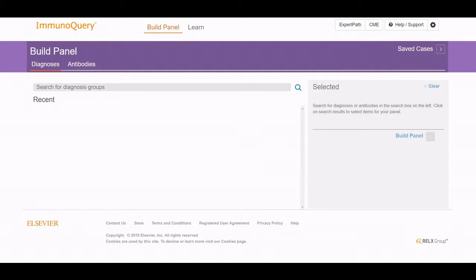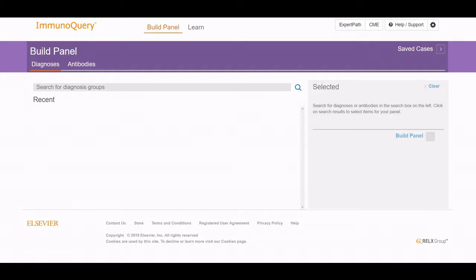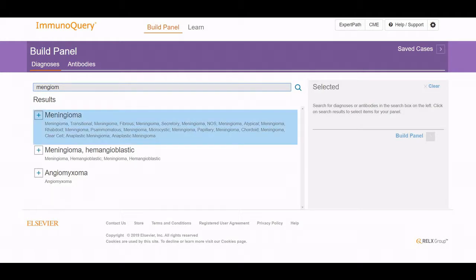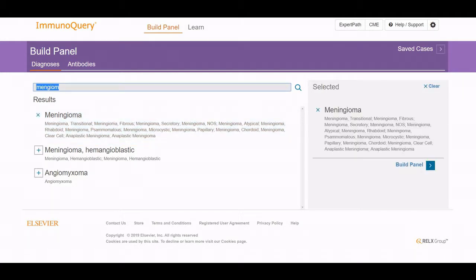Within ImmunoQuery, there are several different functions. We're in the build panel approach, but the learning function can also be used. You can save cases to look at later, and you can build a panel for various diagnostic interpretations. In this case, let's build something for a differential. As you type, it is progressive, and the various factors come into play. I was hoping to use meningioma as one of them.